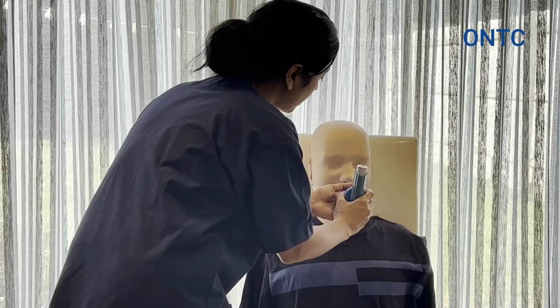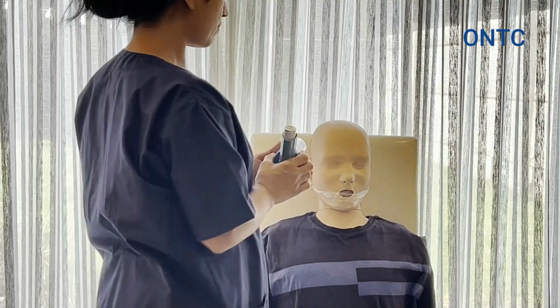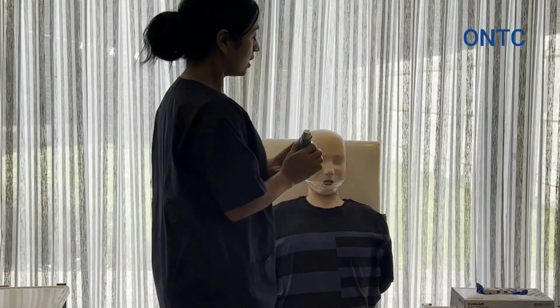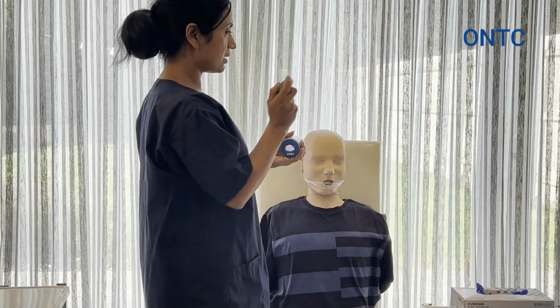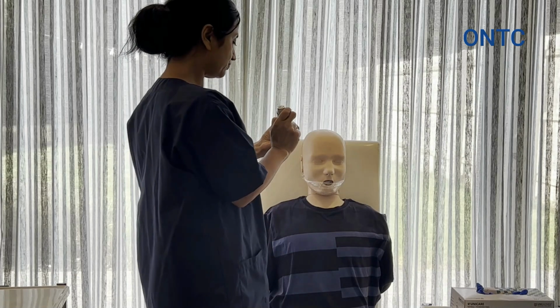Okay, so we're going to take this out. You can exhale now, and we will wait 30 seconds to 1 minute to give you your second puff, because you're written for 2 puffs here. Okay, so we're going to do the same steps again. So we're going to shake it 2 to 5 seconds, and then we're going to attach it again.